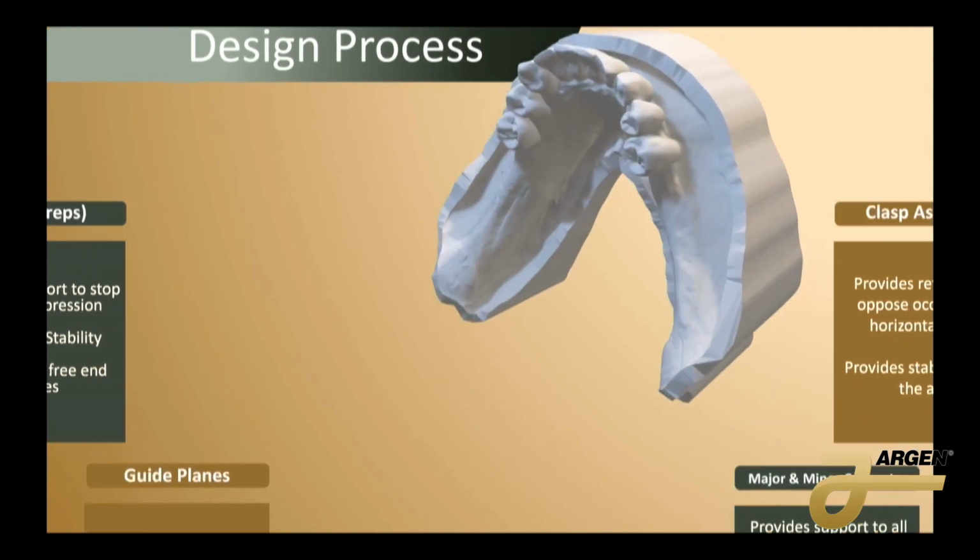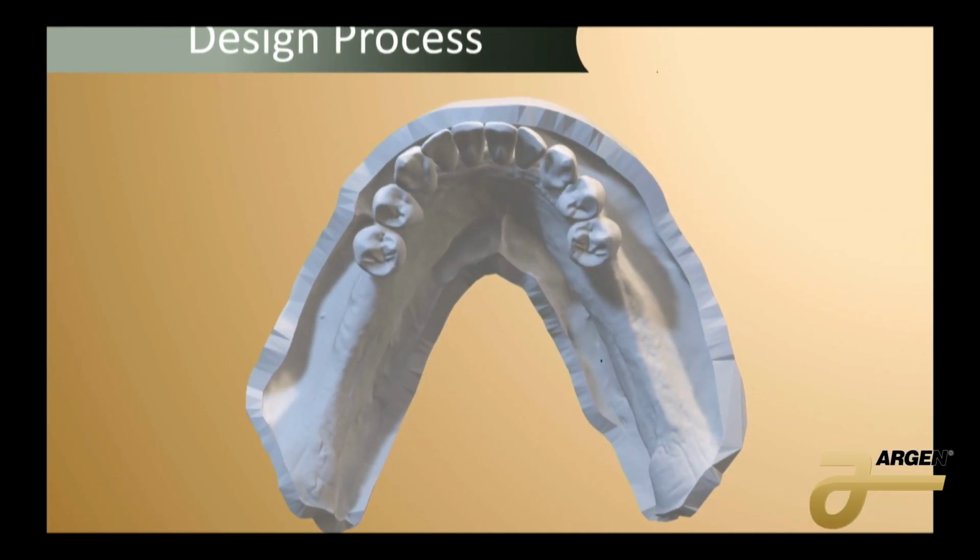So we have some cases here. So here we have a distal free end, meaning we do have a fulcrum. It's not locked in between 2 teeth. So we have a case that's going to rotate, right? How would we approach this? Depends on where your undercuts are. How do we know where our undercuts are? Depends on how we survey it.